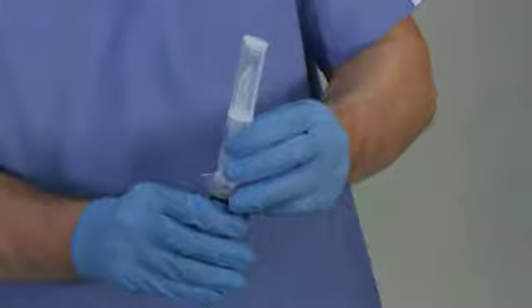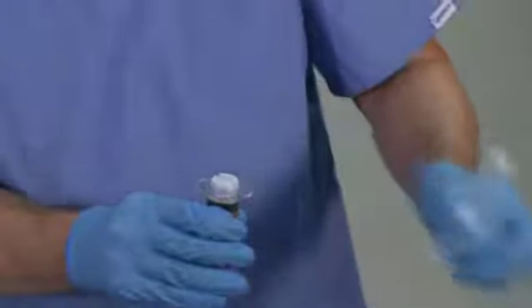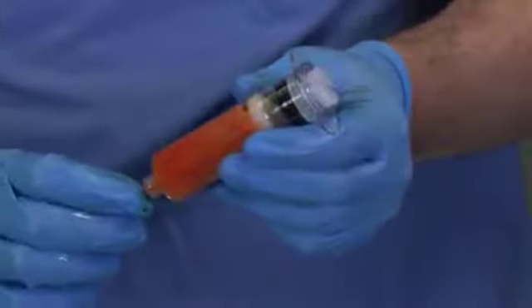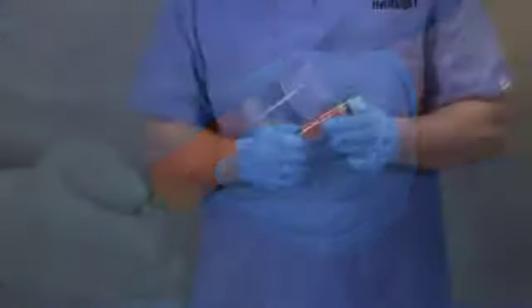Ensure that the plunger handle is completely extended to the back edge of the syringe barrel. Slide the plunger handle laterally to remove it from the process disposable. Be sure to retain the handle as it will be reattached after processing. Attach the green tip cap by screwing it onto the end of the processing disposable syringe. It is important to remove the plunger handle prior to attaching the green tip cap to ensure easy reattachment of the syringe handle after disposable processing.